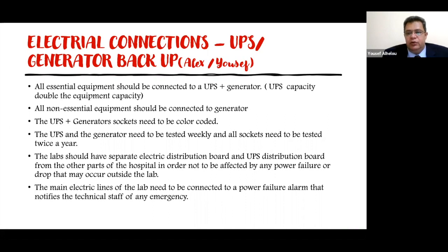Usually we keep the UPS in a room outside the lab at a low temperature, like 17 or 18 degrees only. This will make the life of the batteries longer. In addition, we test the UPS and the generator on a weekly basis, and we document this testing to avoid any failure in the future.